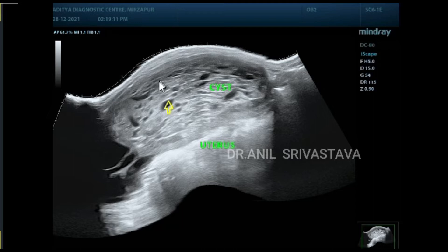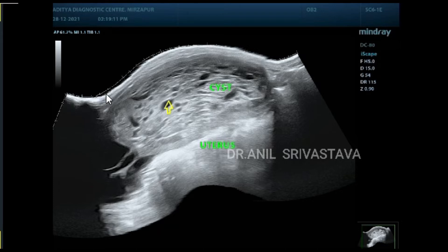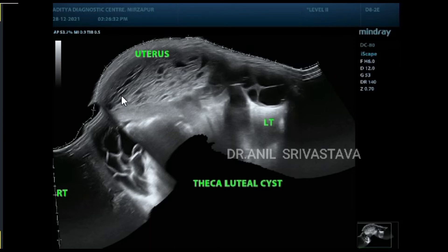This is the uterus with small cystic spaces — this is a panoramic view. In the panoramic view you can see the left ovarian cyst and the right ovarian cyst, with the uterus filled with multiple small cystic masses.